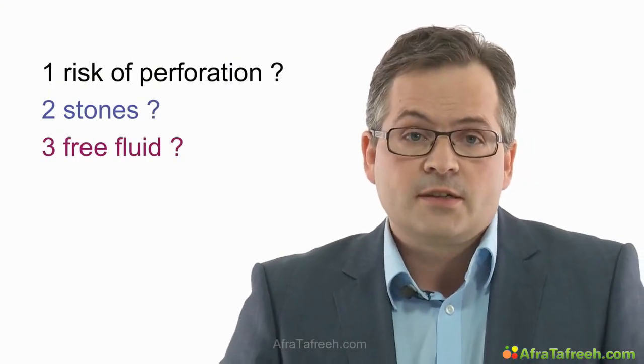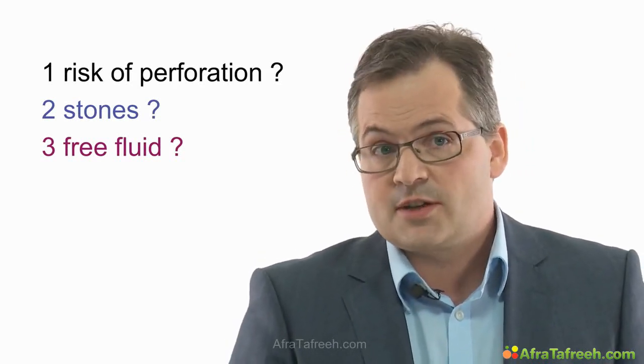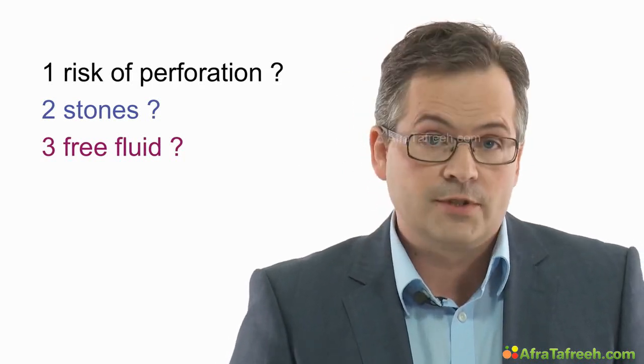We have to answer the questions. How high is the risk of perforation? Are there stones? Is there free fluid nearby?